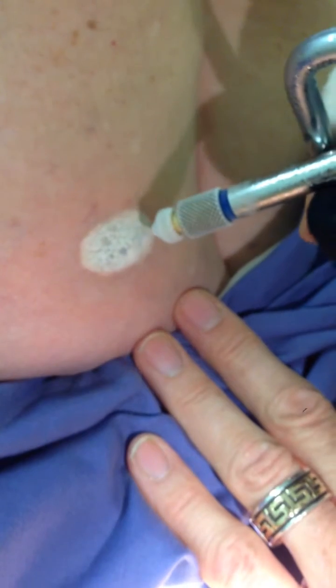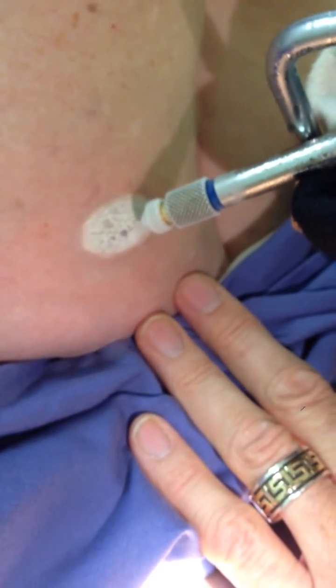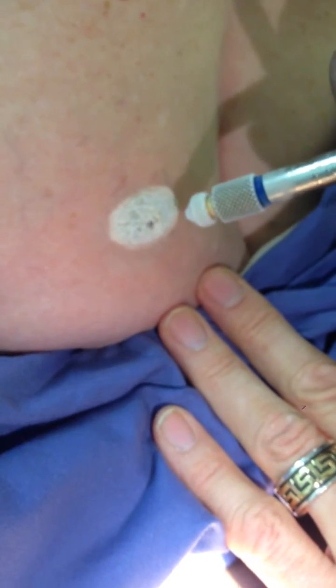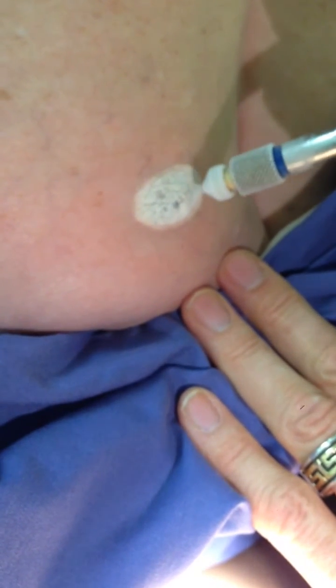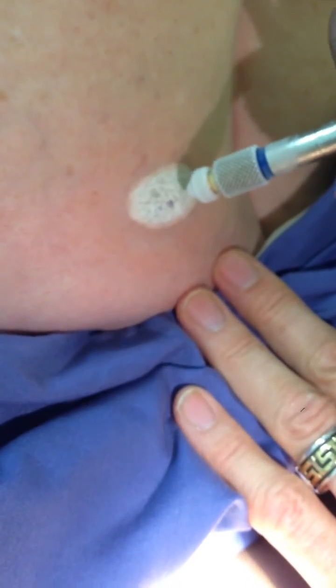You don't want the freeze to go out far laterally. You want it to be only one to two millimeters out onto the normal skin. Most of the time, if you do this with a benign lesion, you only have to freeze it and then just let it thaw naturally, and that should do it. The pulsating freeze is what I'm trying to show you, with a little one to two millimeter border around the edge, and that should do it.